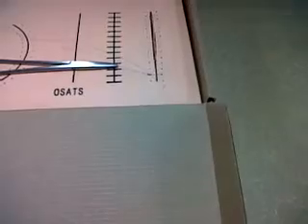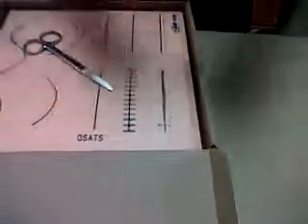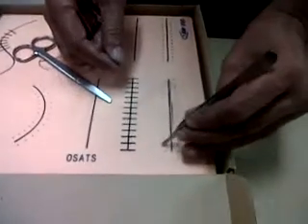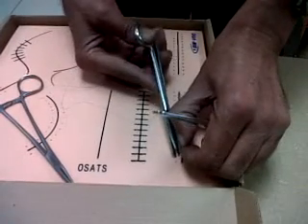So this is a simple stitch. When it comes to cutting the thread, we should always cut approximately half a centimeter to three quarters of a centimeter away from the knot. There are two reasons: number one, if you cut it too close to the knot we might allow the knot to slip; and the second reason is that when we have to remove the sutures, we will have something to grasp it — we can remove it by putting the pointed end of the scissors under the knot loop and cutting and pulling it out.